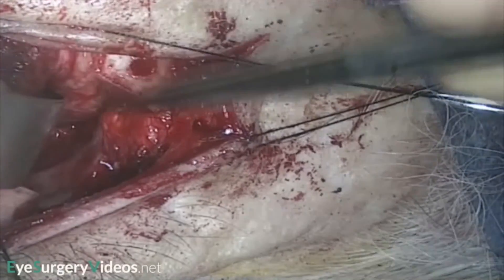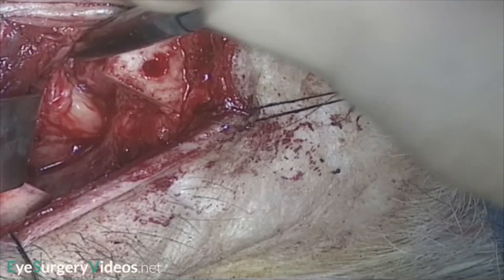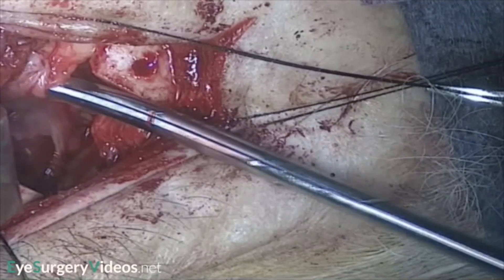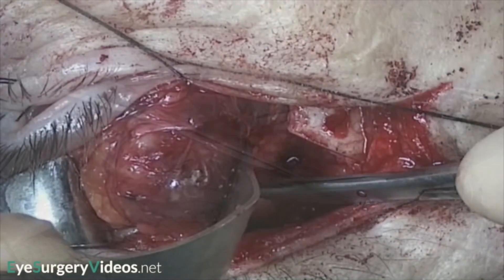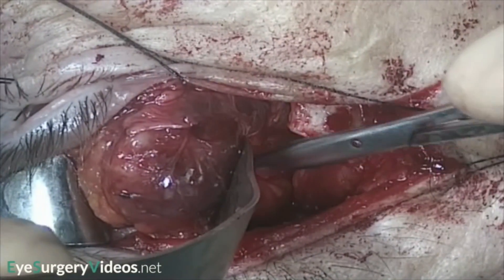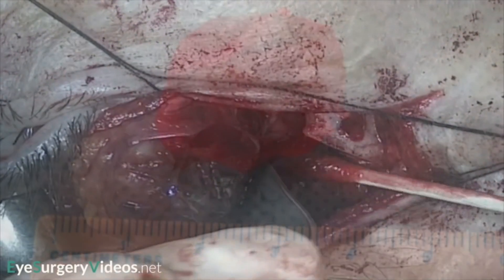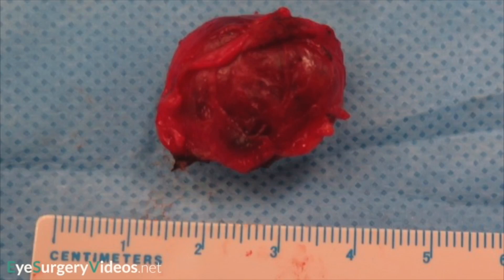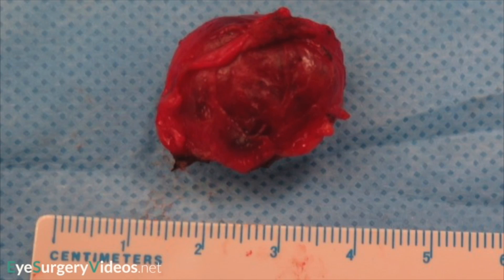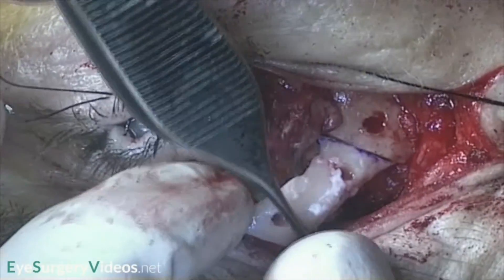The tumour is then gradually dissected out using close blunt scissors, malleable retractors and cotton buds. Care is taken to ensure a cuff of normal tissue where the tumour is adherent to adjacent structures. Once the tumour is excised, the bone can then be replaced and sutured, in this case with prolene.